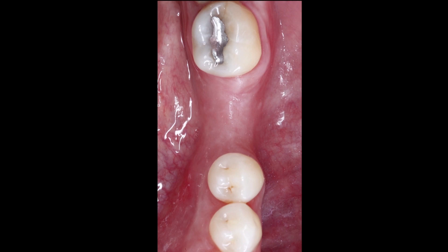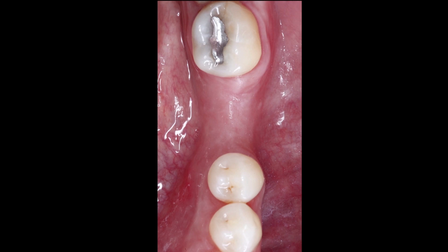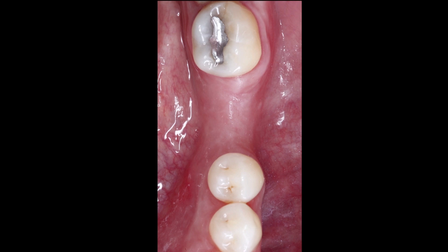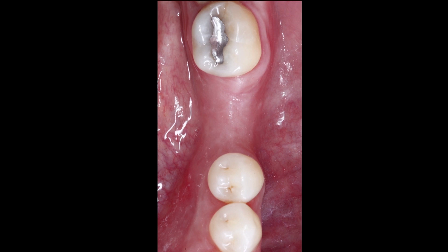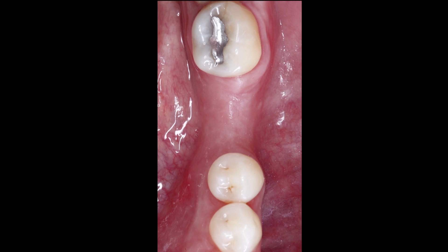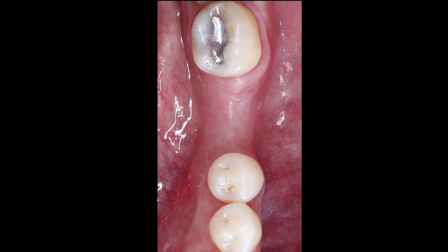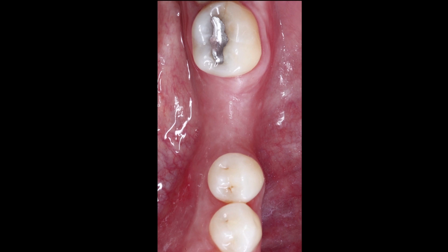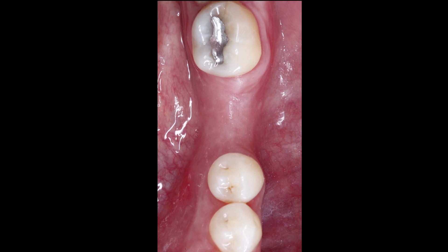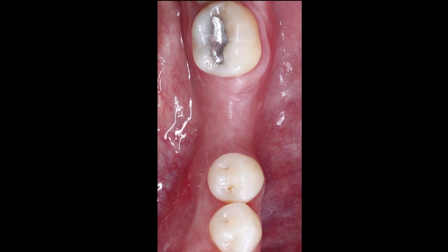Hi everyone and welcome back to another case of the week. I want to share this case with you — if you're incorporating implant dentistry into your dental practice, cases like this would be ideal to start out with. Repetition with cases like this will lead you to expanding your knowledge base and comfort level, so you can expand what you're doing within your practice.